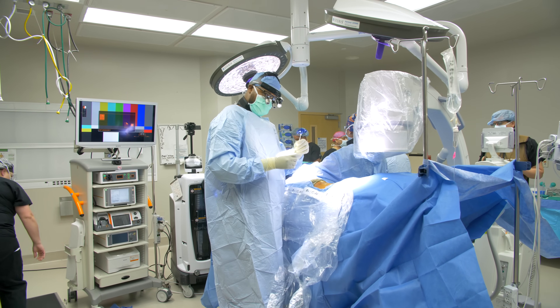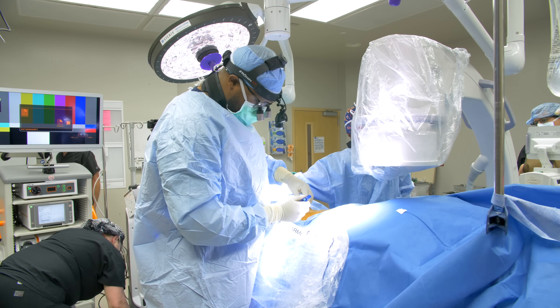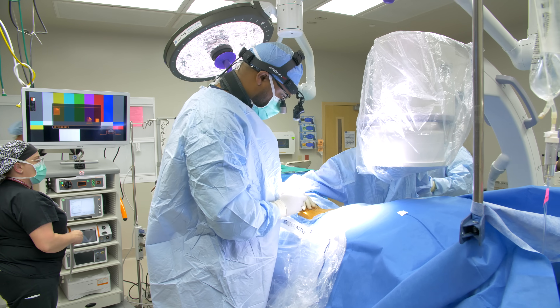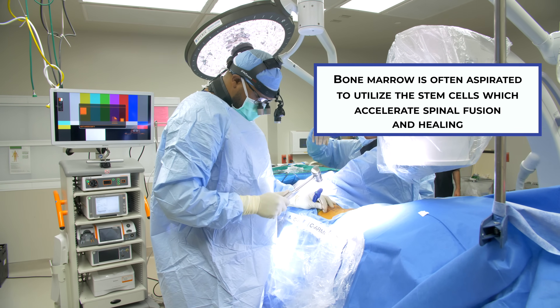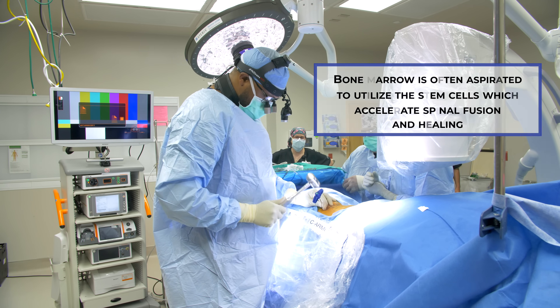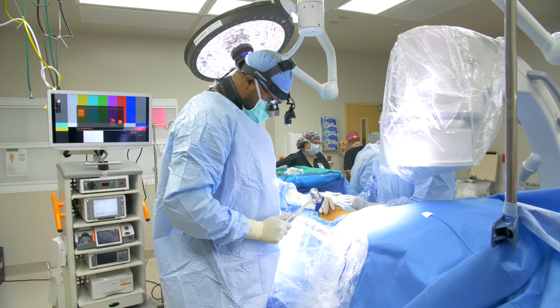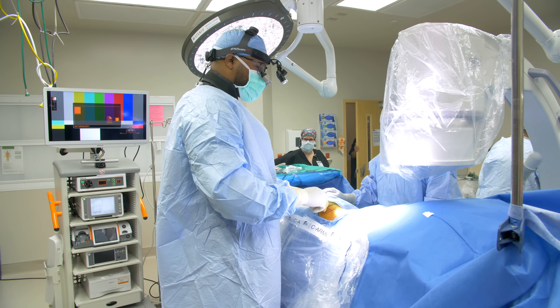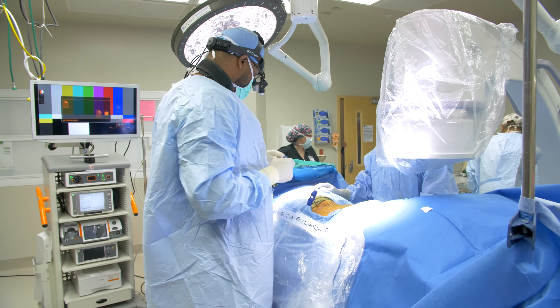First we're doing a bone marrow aspirate using a Jamshidi needle to take a sample of blood through the bone — essentially collecting stem cells. This syringe goes into the iliac crest to draw blood, which we'll mix with our bone graft to get this level to fuse together.